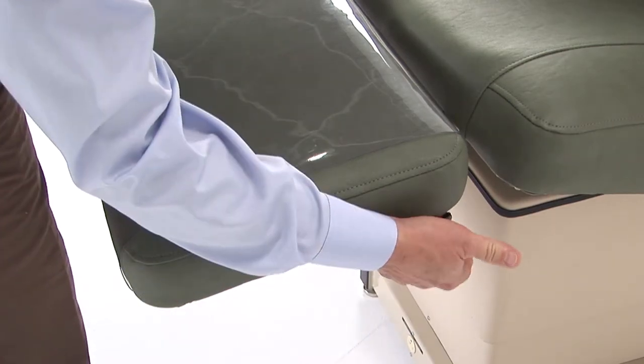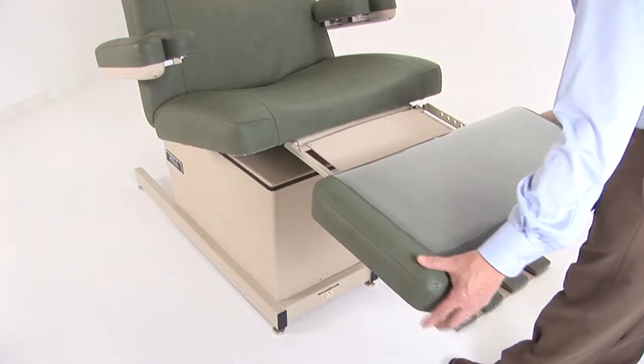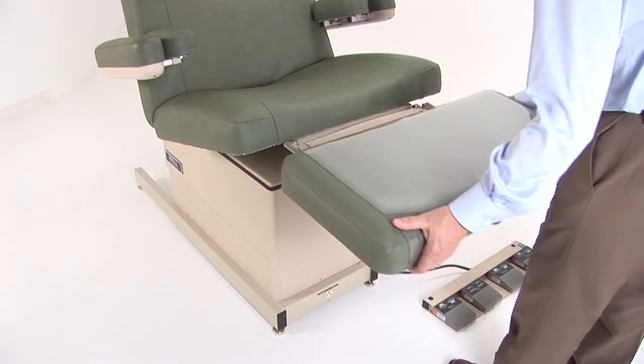The footrest is adjustable to accommodate taller patients. It can slide out up to 10 inches and lock anywhere in between.